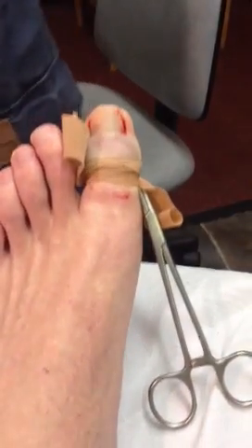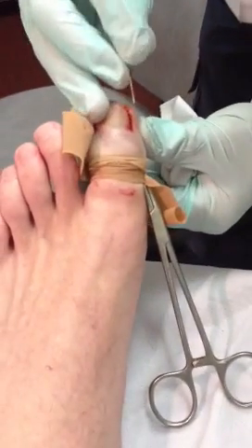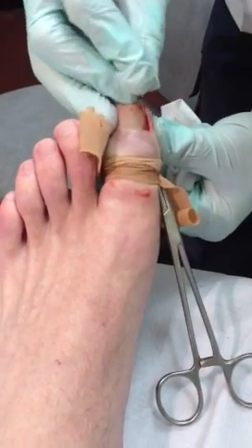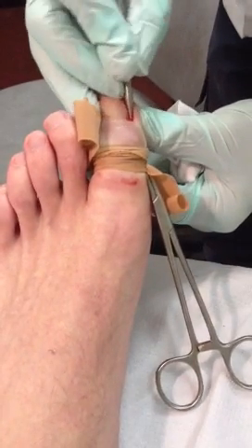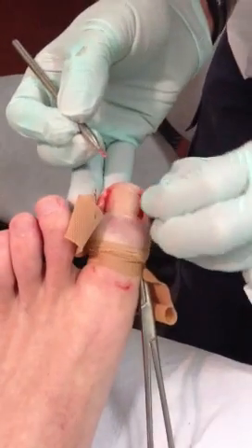Let's do it again. You okay? Yeah, fine. You sure? Yeah, brilliant. Well, I'm brilliant — I'll never be better, having an operation. It's alright to be honest. It's nice to have the thought that you're not going to have that ingrowing toenail ever again.